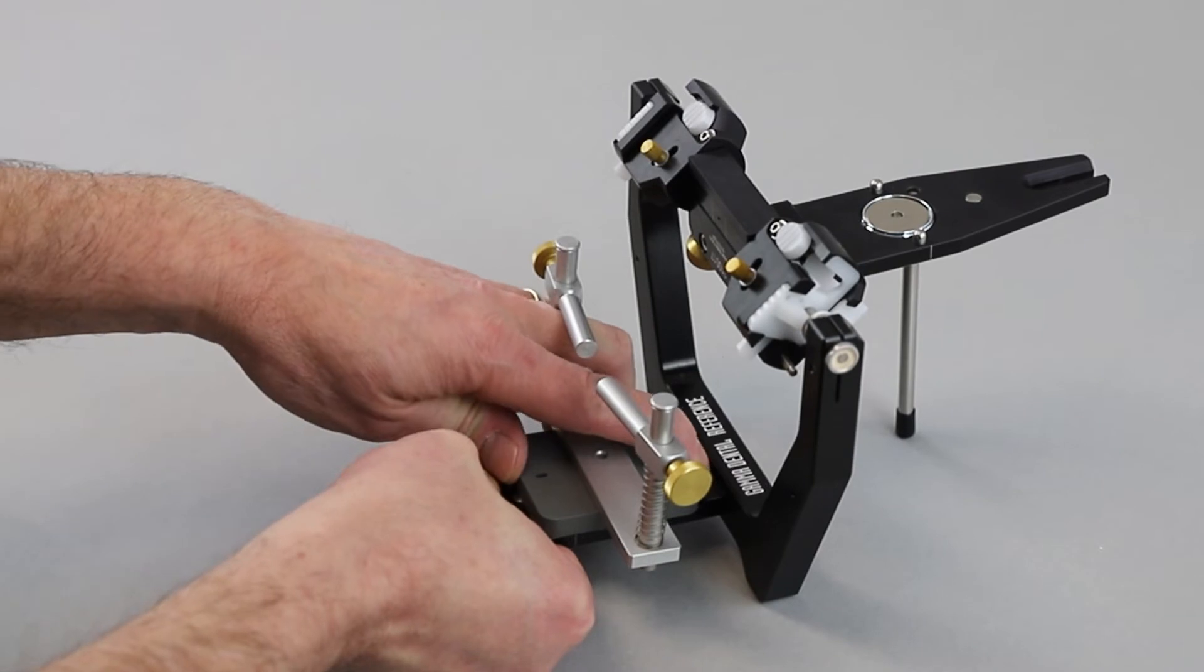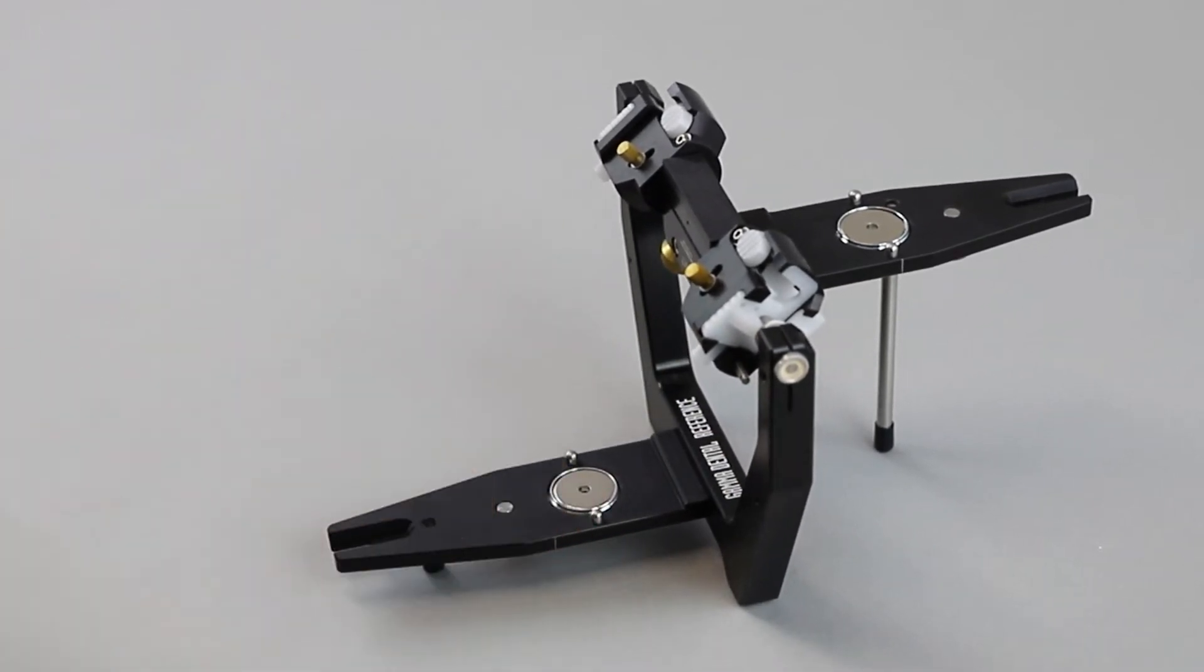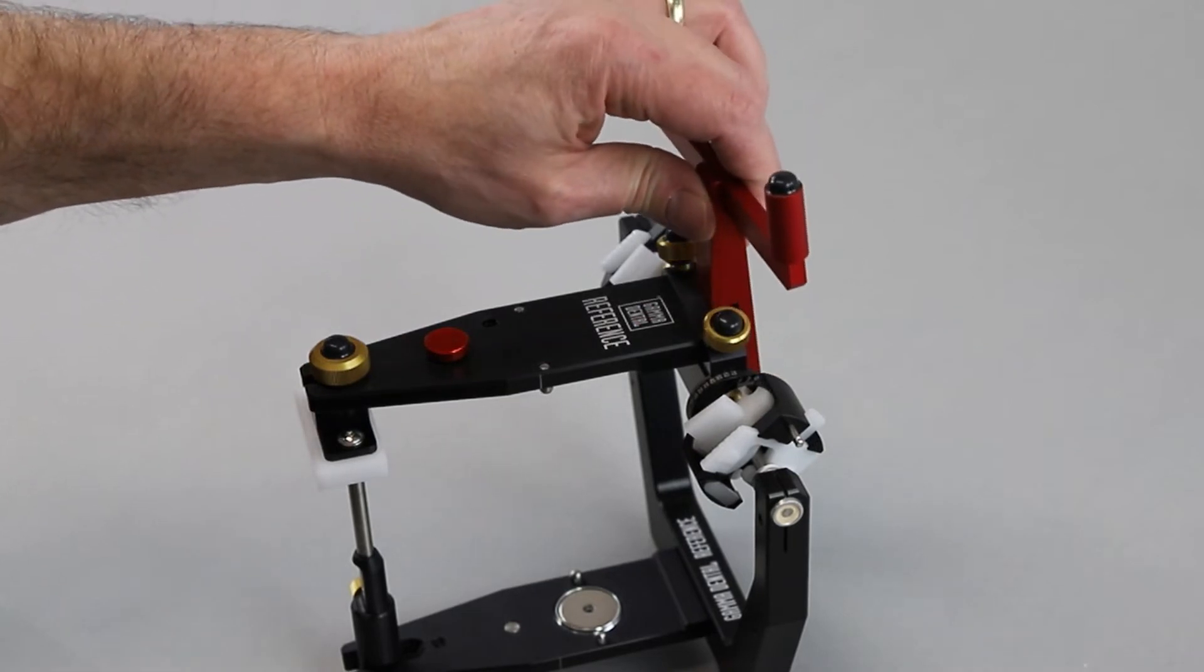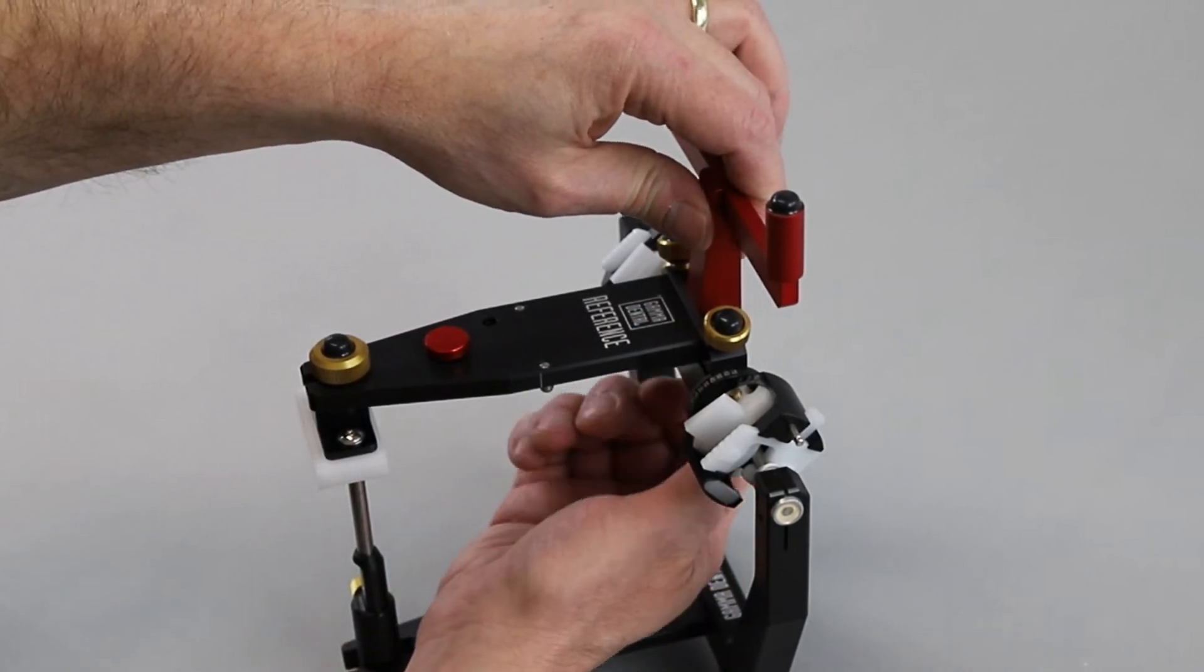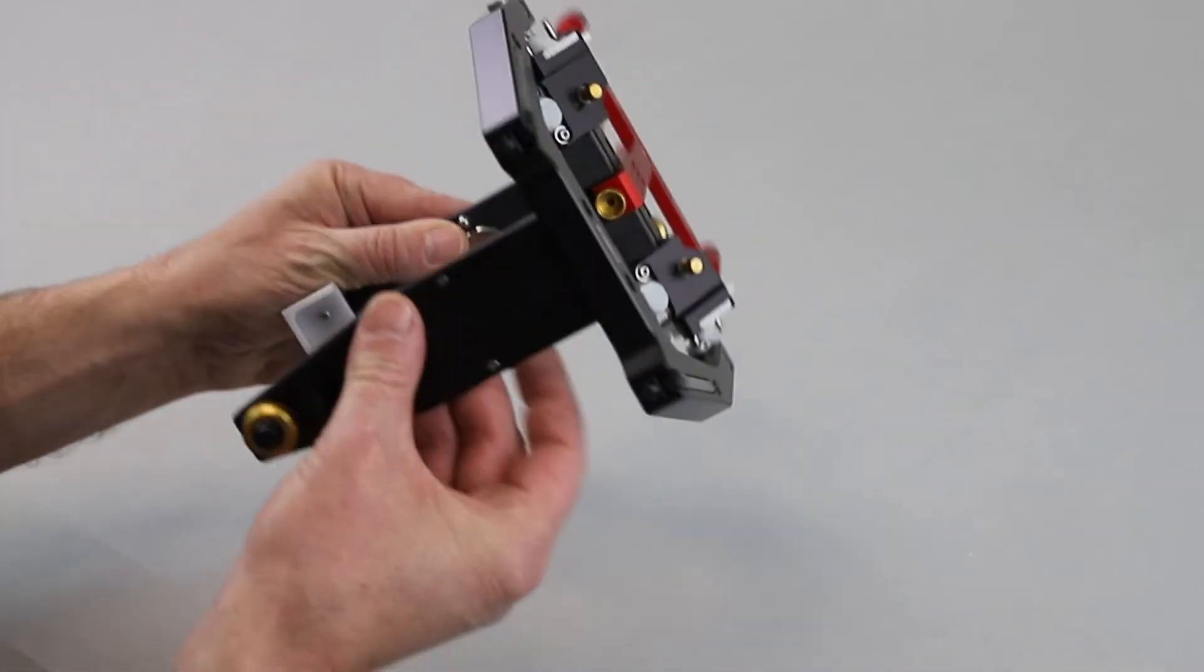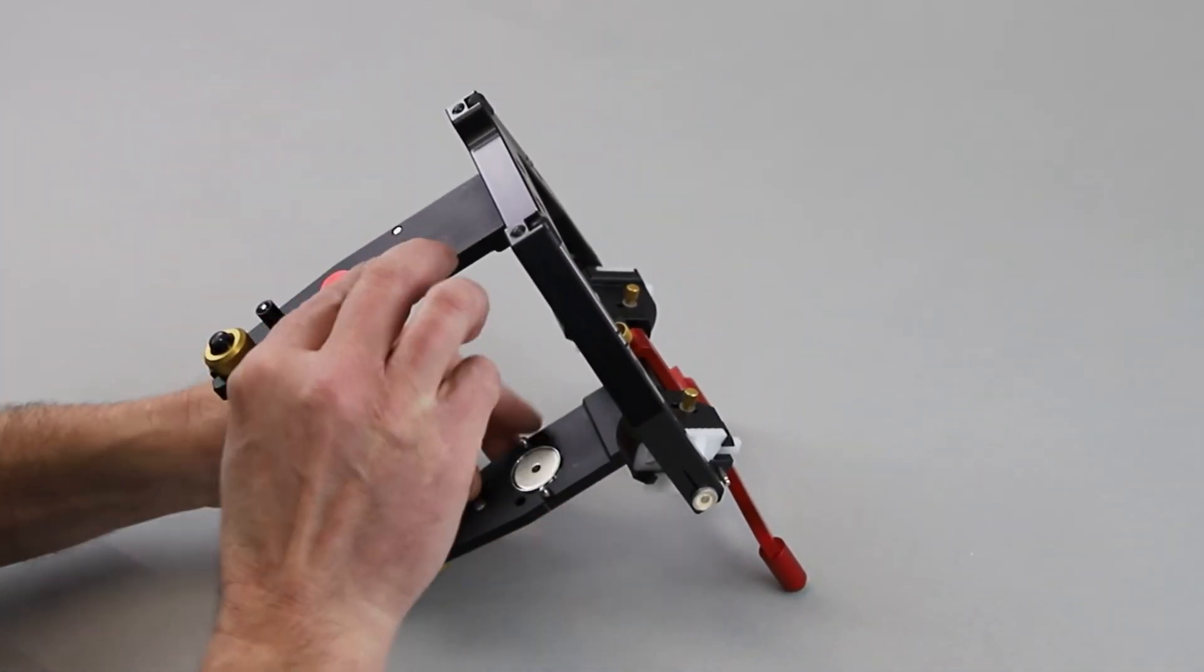To achieve a stable upside down position of the articulator and to avoid errors due to manual handling, attach the mandible mounting clamp to the upper part of the articulator. Lock the articulator in centric and place it upside down on the table.